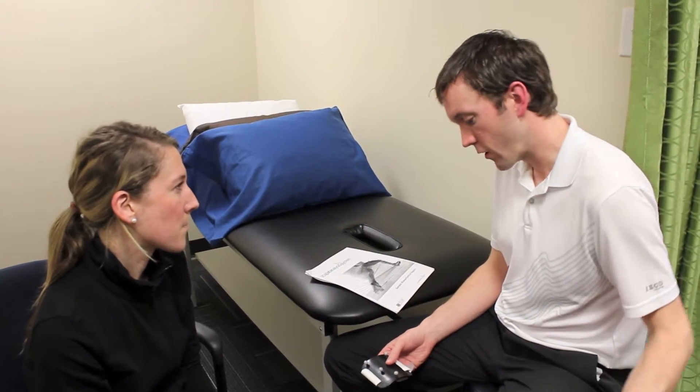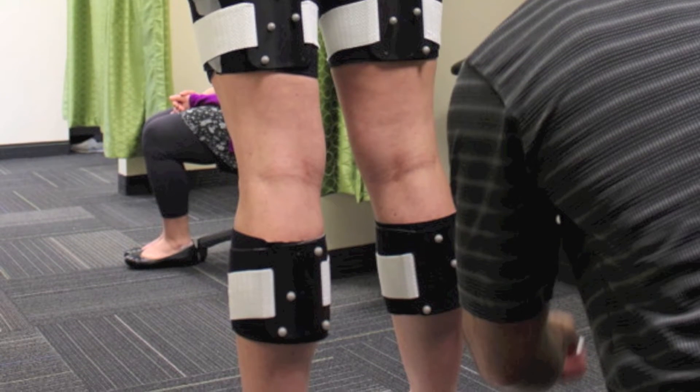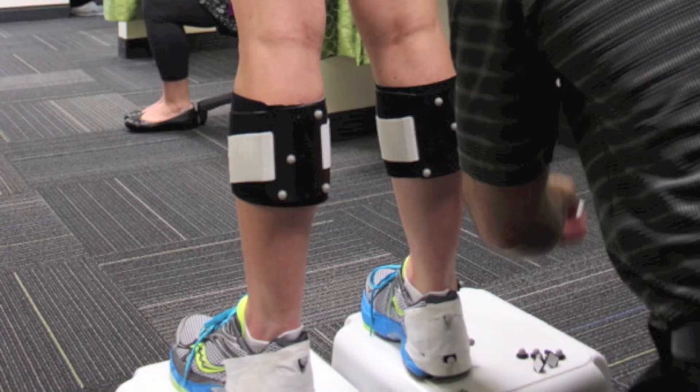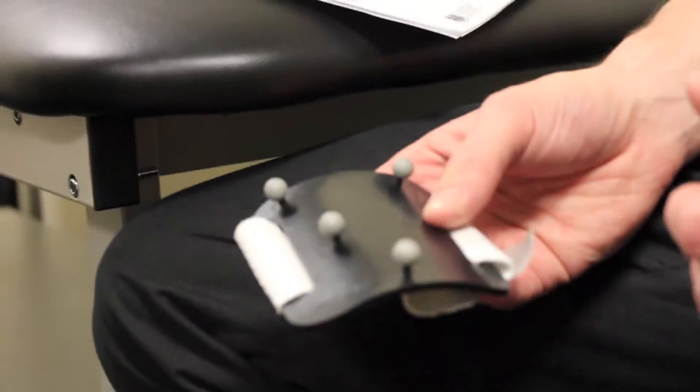We're going to be putting these on your thigh, your calves, on the sneakers that you'll be wearing, as well as one on the pelvis. These will help capture the motion that's occurring in the different joints of your body.